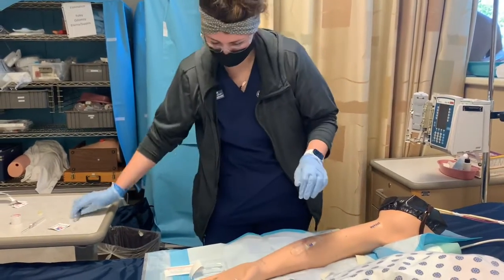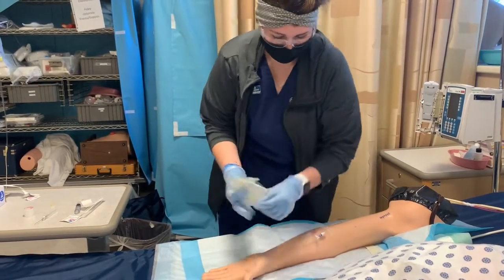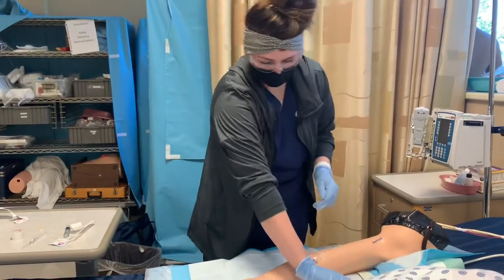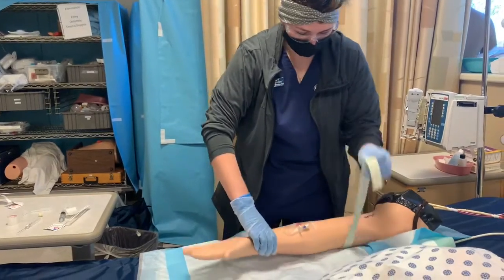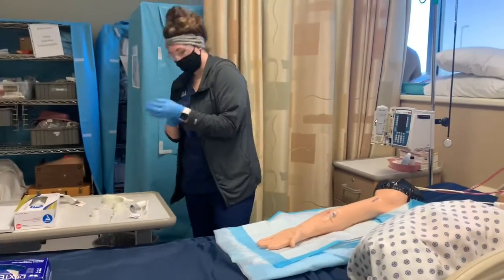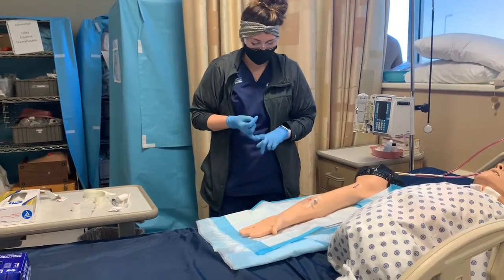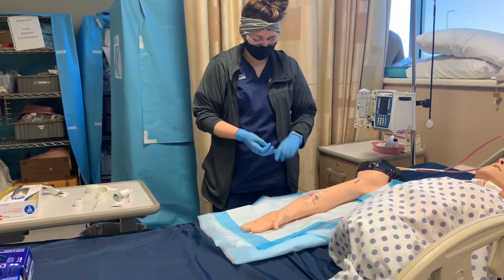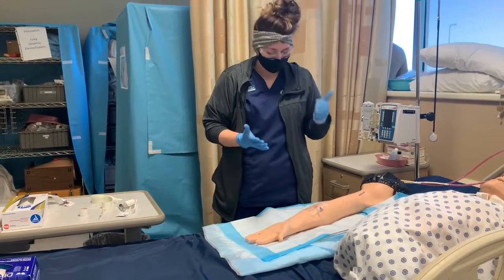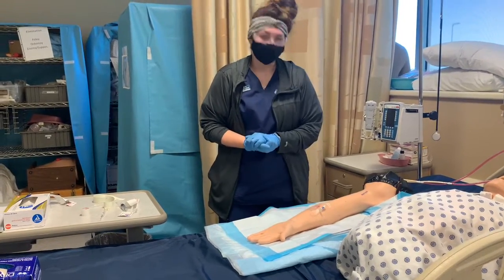I would clean up my supplies. And then I would make sure she was comfortable, make sure she didn't need anything. Make sure all this is off the bed. And then I would remove my gloves. I would wash my hands, and then I would document the time, the date, the location it was placed, how many insertion attempts it took, the amount of fluid and the type of fluid, and how the patient tolerated.